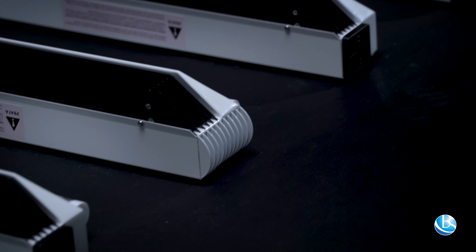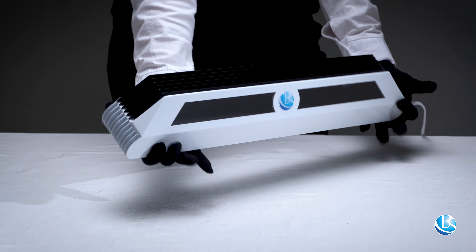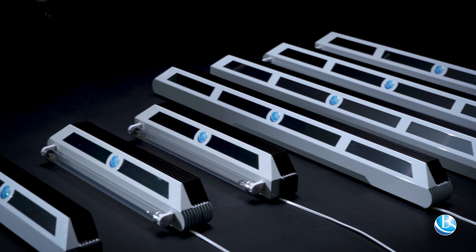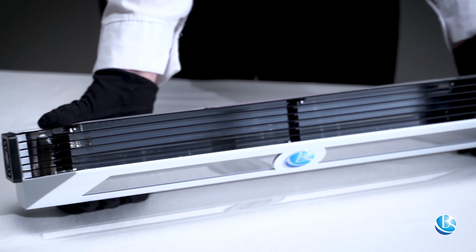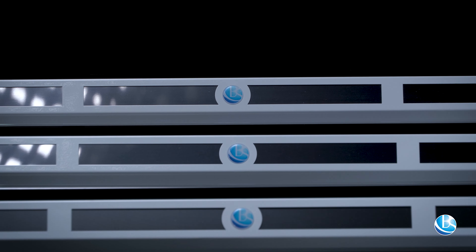The screen blinds are made of a material coated with black matte paint of a special composition, the coating of which absorbs UV rays to the maximum, excluding their reflection into the lower part of the room.